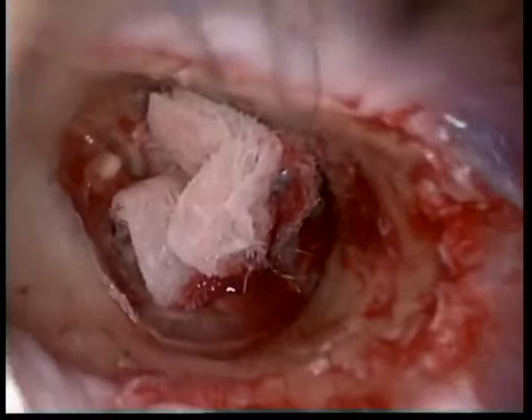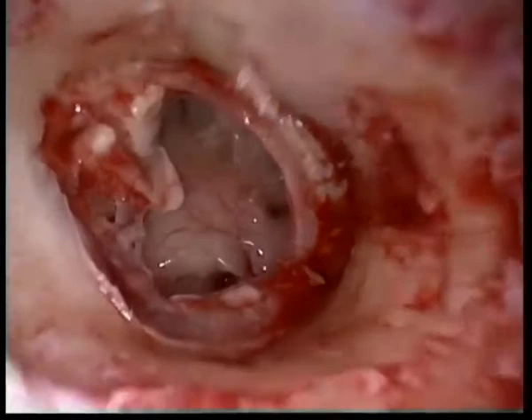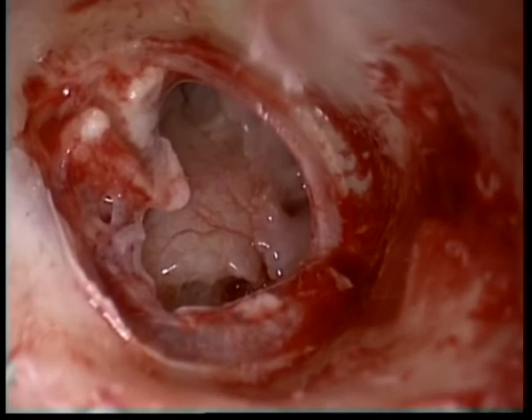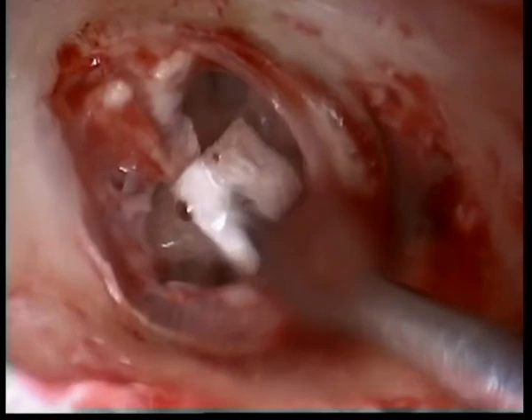Gel foam, ready? Yeah. So I always pack the middle ear with gel foam. Some people don't do that and don't see the value of that, but I do it. A bit of bleeding, but I think it would be fine. Give me gel foam, please. I need bigger pieces. Don't put too much ointment. It's not crushed. But anyway, give it to me fast.